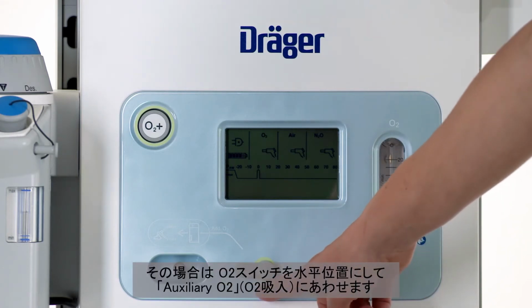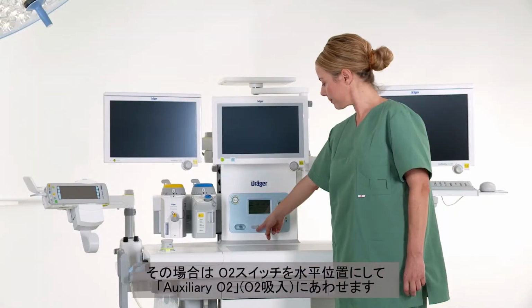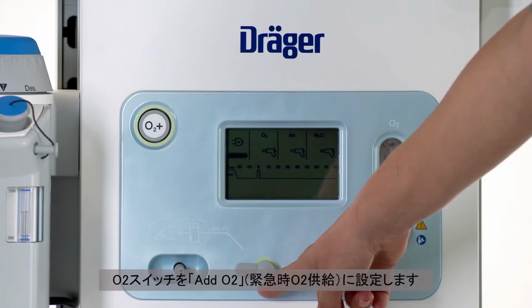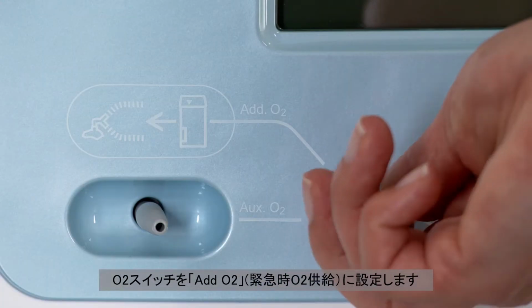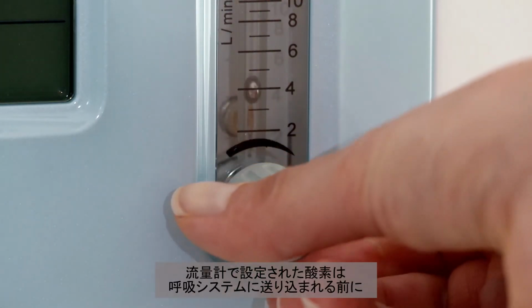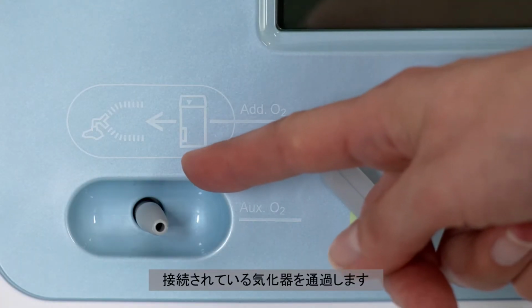To do this, the O2 switch must be in the horizontal position, showing auxiliary O2. If you need to dispense additional oxygen into the breathing system in the case of an emergency, set the O2 switch to add O2. The oxygen set by the flow tube will pass through the connected vaporizer before flowing into the breathing system.